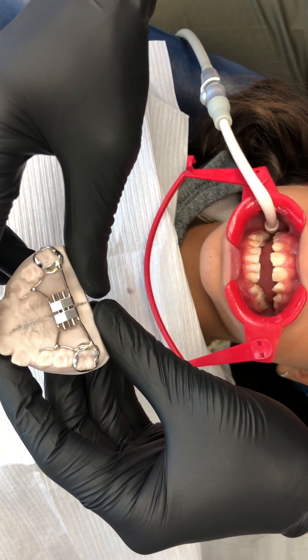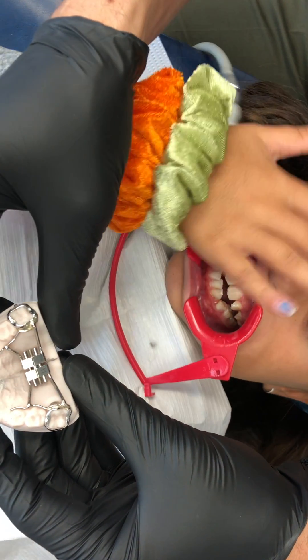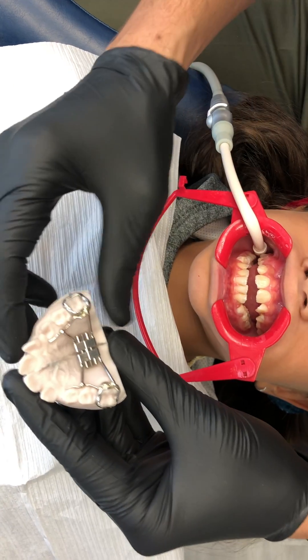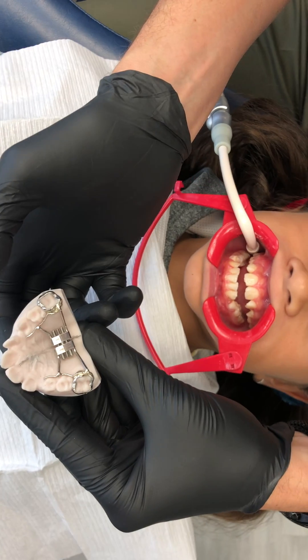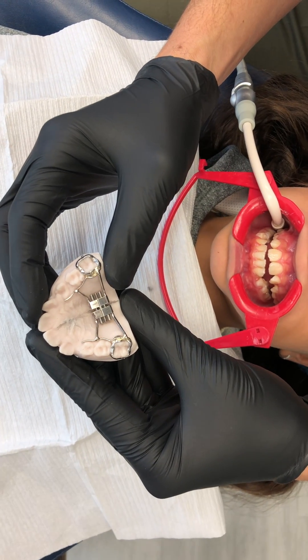What we're doing today is cementing a laser sintered expander. The bands are custom laser sintered, so no fitting or separators are necessary because it slides right onto the teeth without going in between the contacts. We've already tried this in the patient's mouth to verify that it fits, and as usual it fits perfectly.